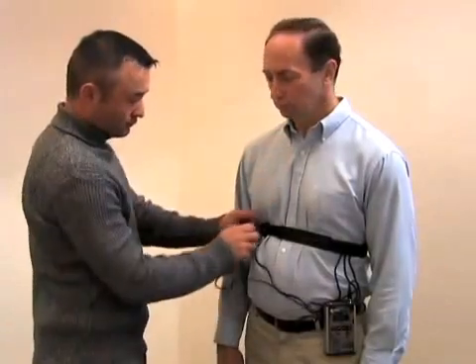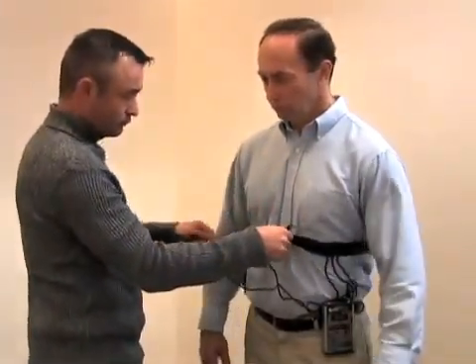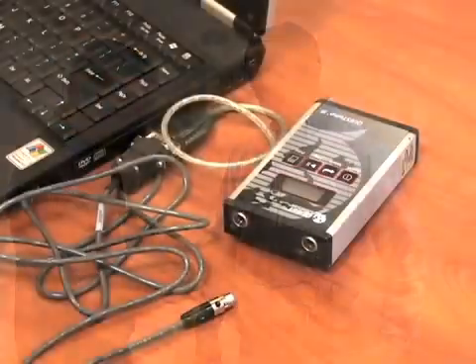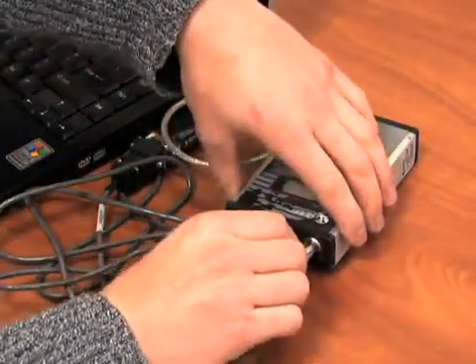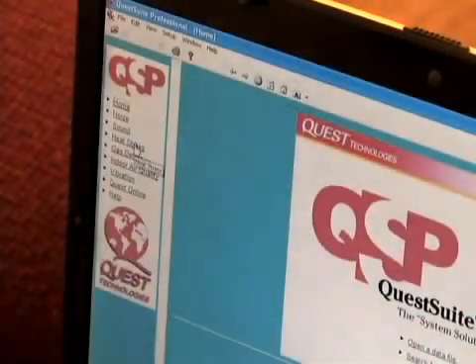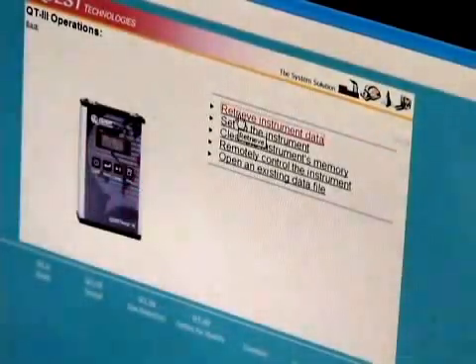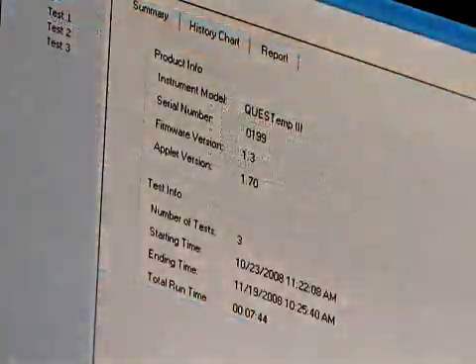Remove the monitor from the worker and disconnect all attachments. Prior to downloading the data to a PC, connect the cable to the PC and to the unit, install the CD, open it, and follow the instructions. Click on Heat Stress QT3, retrieve the instrument data, name the file, click retrieve, and the data will download and appear on the screen.